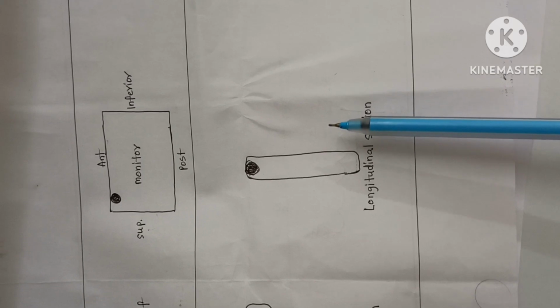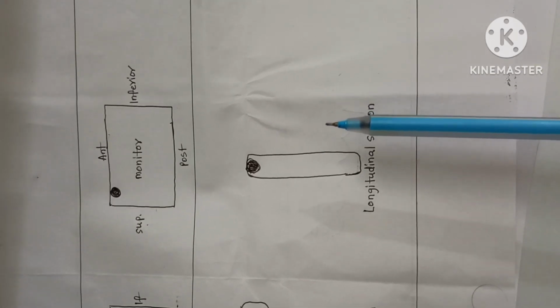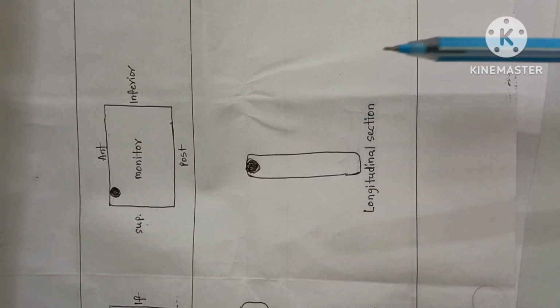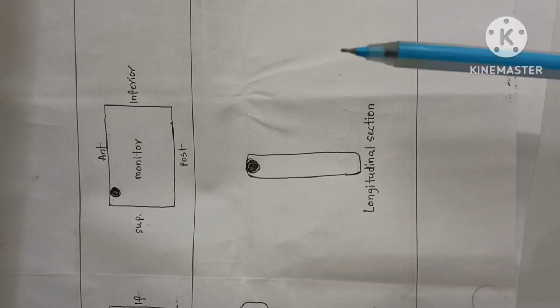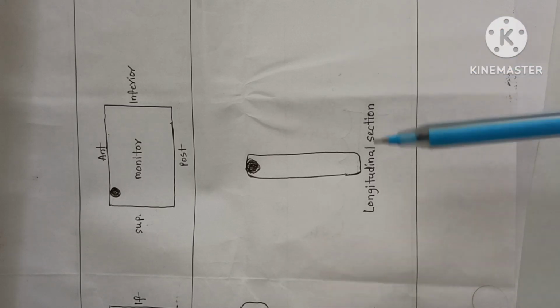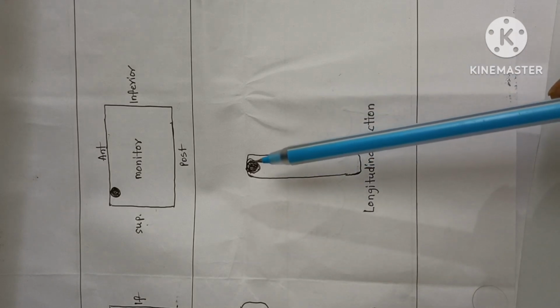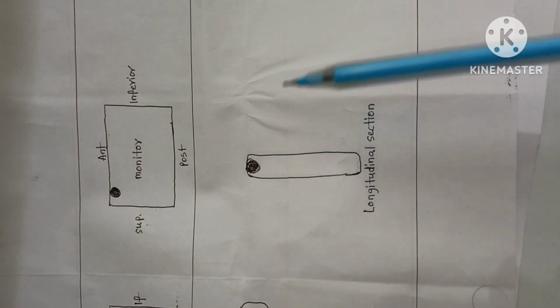In longitudinal section, that is longitudinal section with respect to the organ itself, not with respect to the body, we are cutting the organ longitudinally. In longitudinal section, the probe marker, this is a probe marker, should be towards the patient's head.